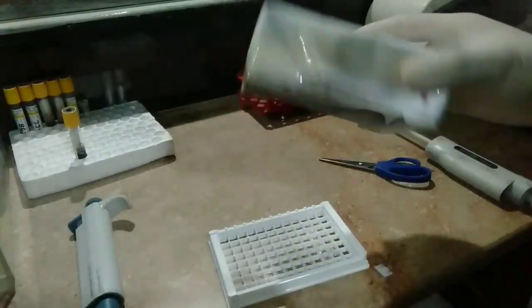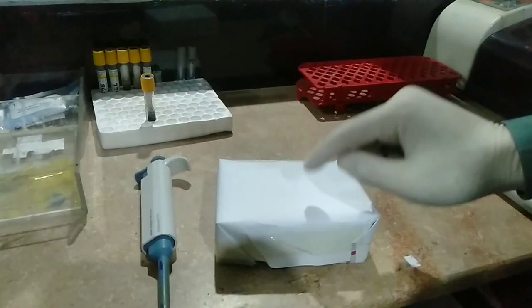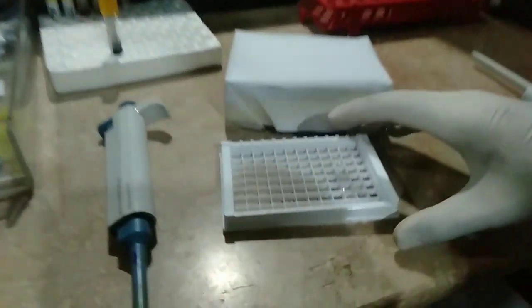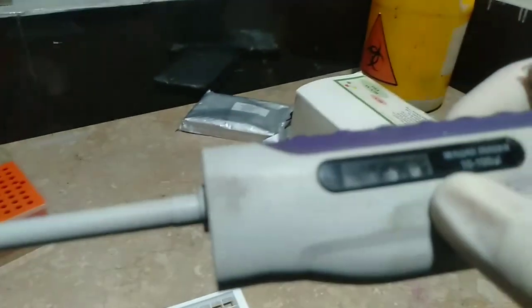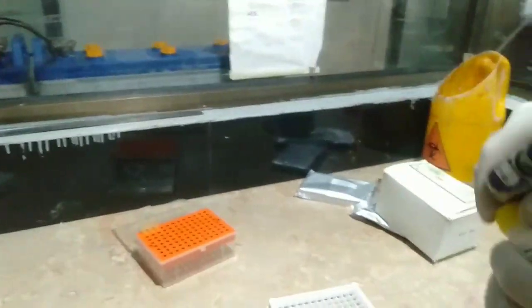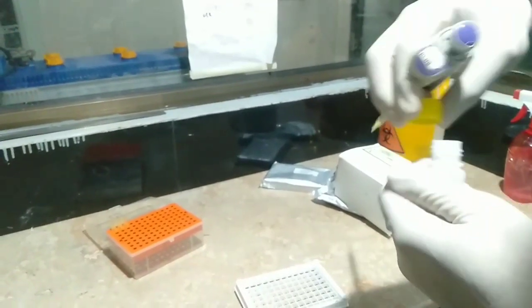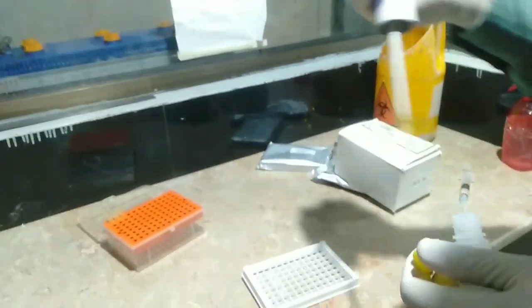After adding the chromogen solutions, we keep the micro titer plate in dark incubation — no light — inside a box at room temperature. After 10 minutes of dark incubation, we check the color. Then we add 50 microliters of stop solution into all three wells respectively — first, second, and third — to stop the reaction process.